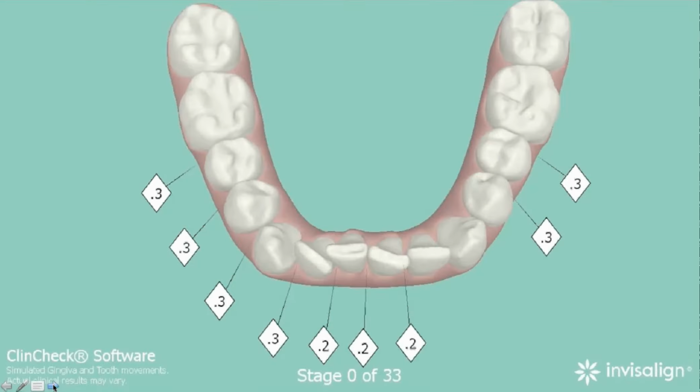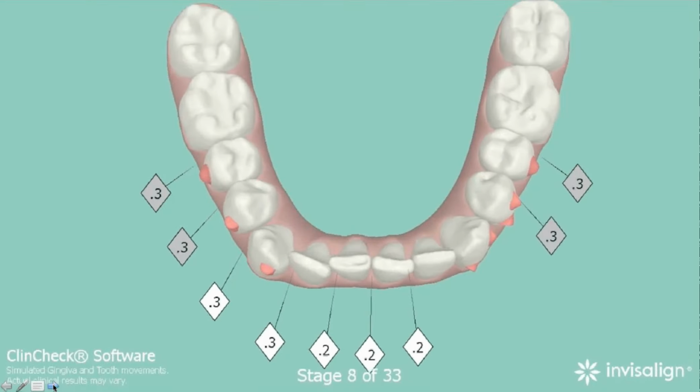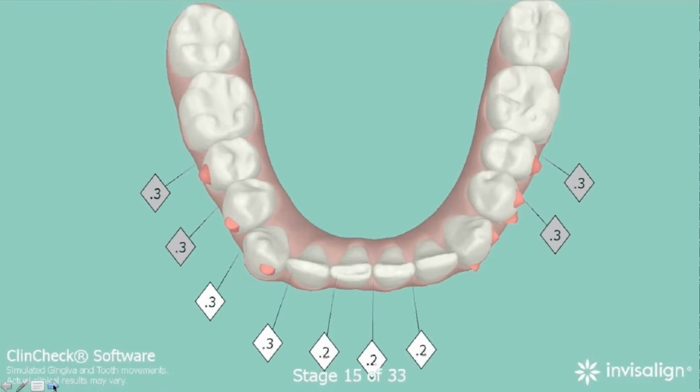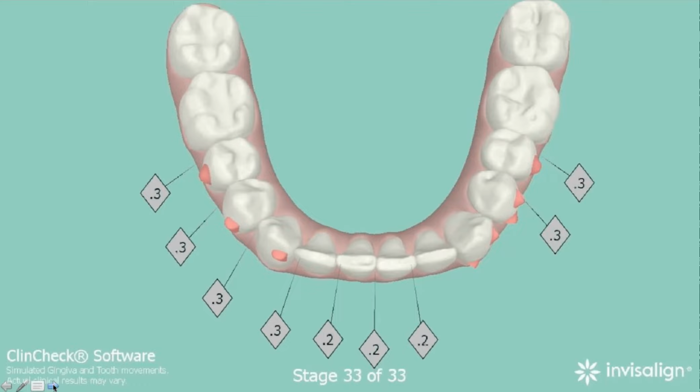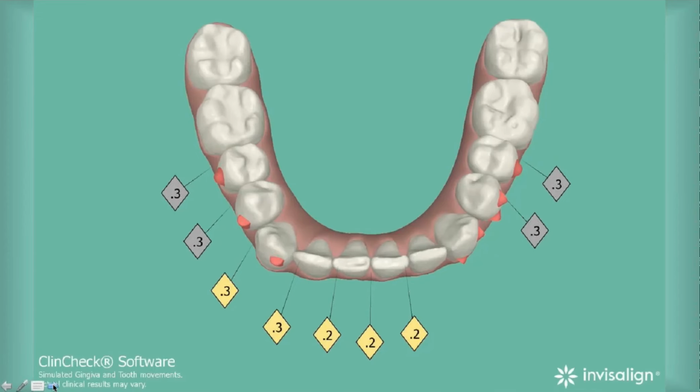Let's look at some good examples one more time. This is a crest that's just right. The IPR is all done at once. Now, don't count the bicuspids, because the bicuspids are in kind of a different game plan because they can be earlier or later, and they're not really part of the crest. It's the anterior teeth that are part of the crest. Watch that crest. There it is.